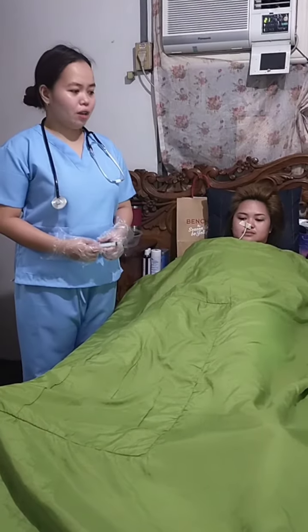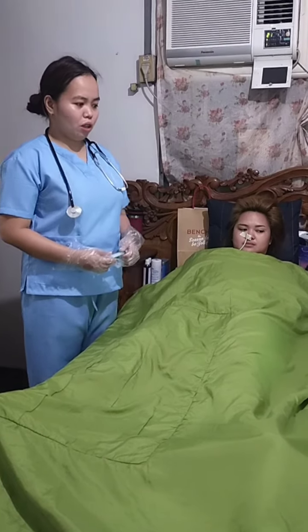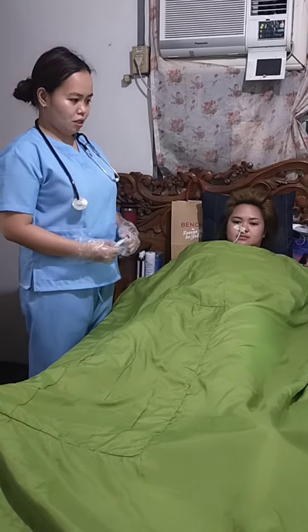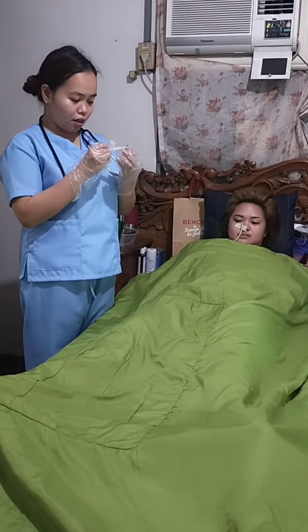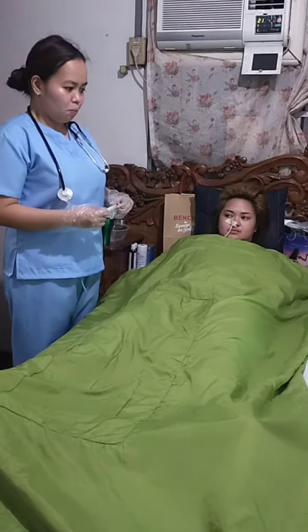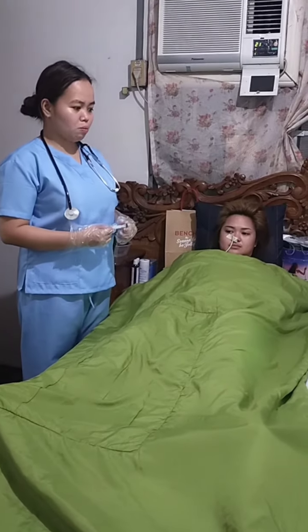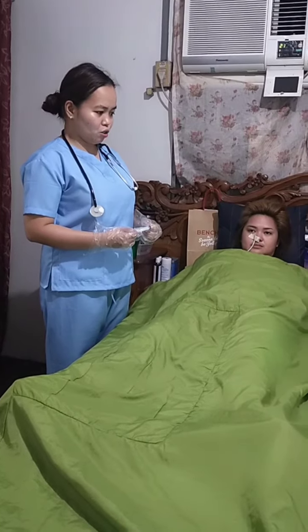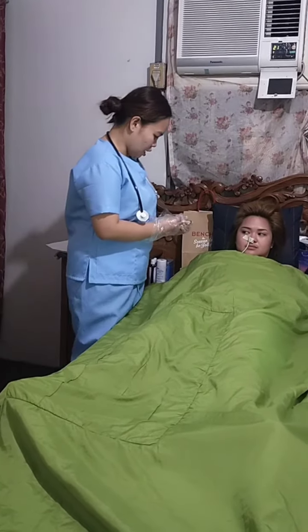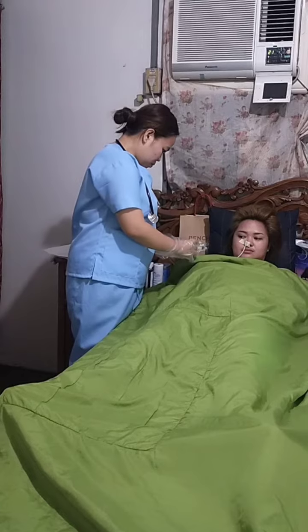So now we're going to inject 10 to 15 ml.